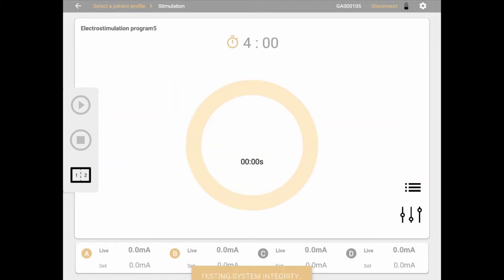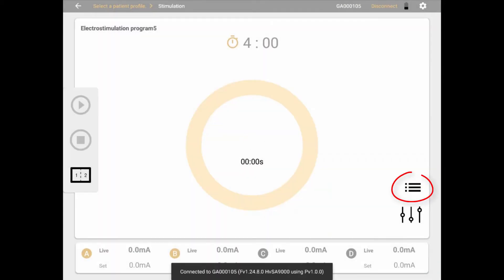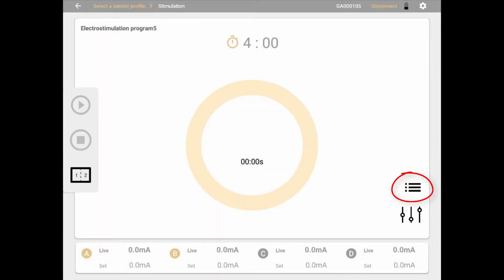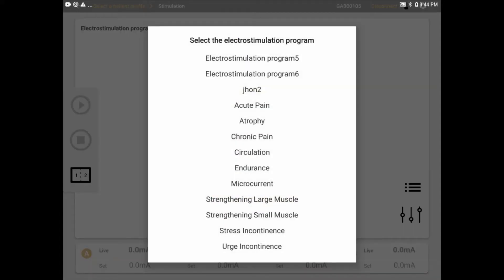An electrostimulation program includes all the waveform properties, delivery options, and timings of a program. To select an existing electrostimulation program, click the list icon — the first of the two icons on the bottom right of the screen. A pop-up will come up with a list of available programs. In dual mode, make sure you select a program for each pair of channels.